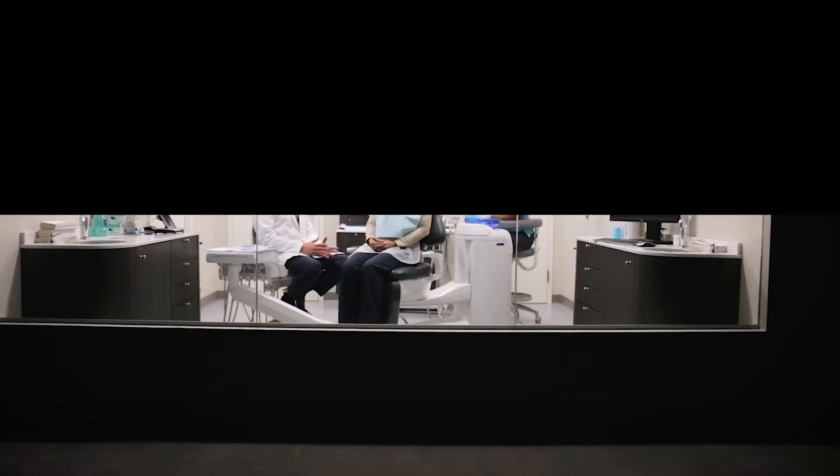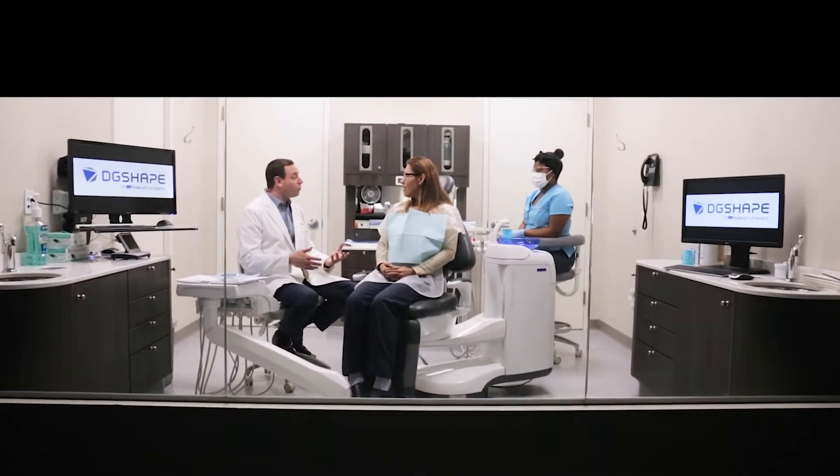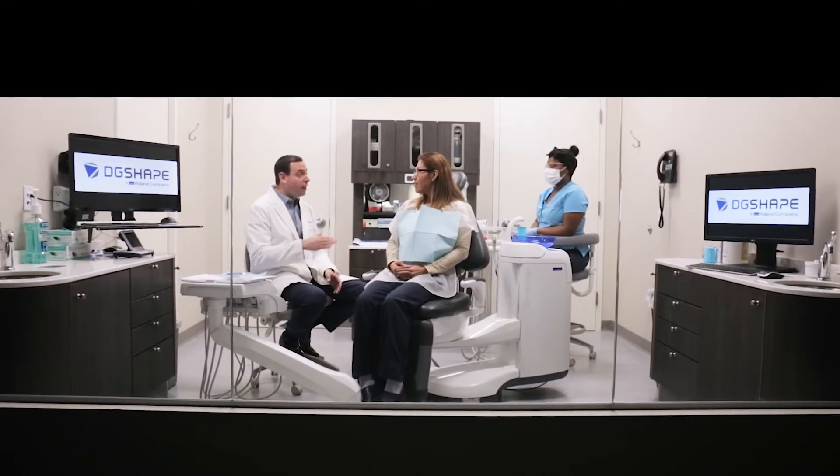The way that we use digital technology to enhance that experience and that workflow is the beauty of digital dentistry in our facility and how we perform treatment for our patients.